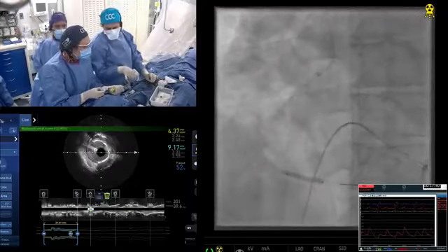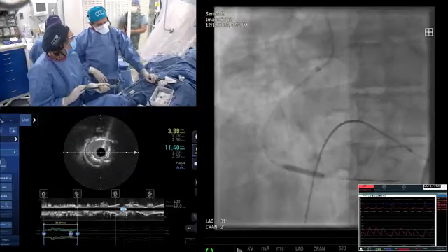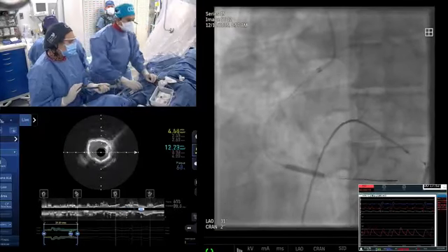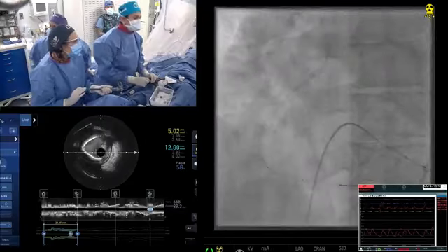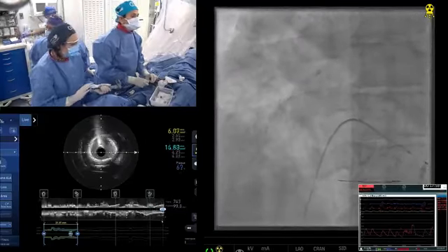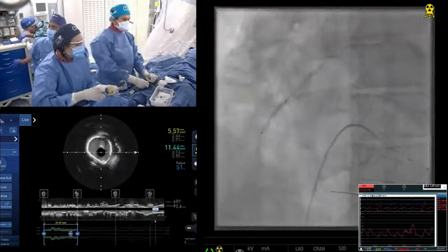And so key is let's keep the device for the purpose it is made for, and that is the rotational atherectomy. Unless somebody can show by IVUS that low speed versus high gives you a better gain, we still continue to do the same, our 150,000 RPM. And if after 4 tries the lesion did not cross, then we go to 180. That has been our practice so far.